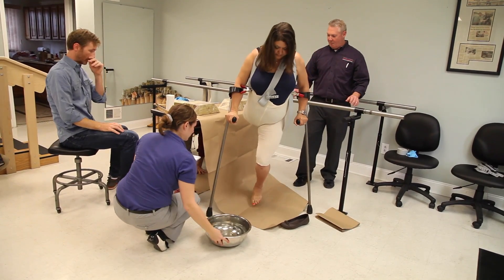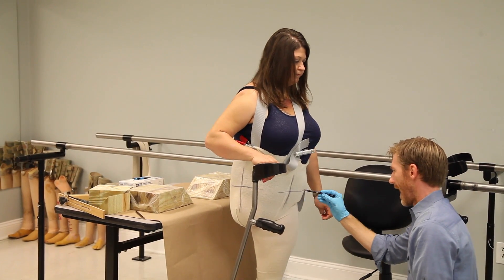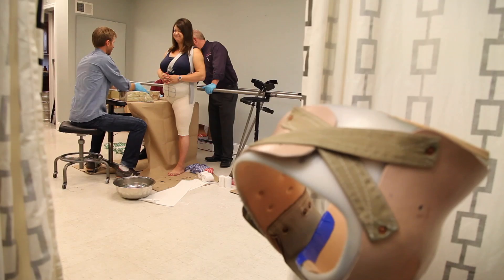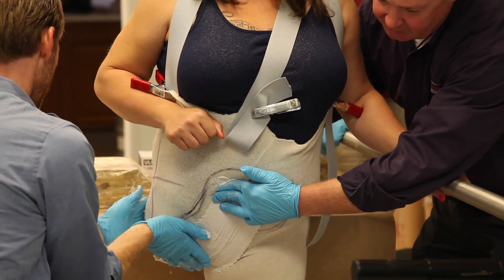Ashley is a hip disarticulate patient, which means that she's lost her limb at the hip level. So besides the hip, the knee joint, and the ankle, she's got a lot to contend with. When you're missing three joints — your hip, your knee, your ankle — versus missing one or two, it does really change things. Everything from hills and steps is a little bit different for a hip disarticulate amputee.